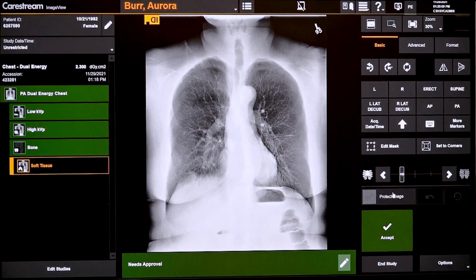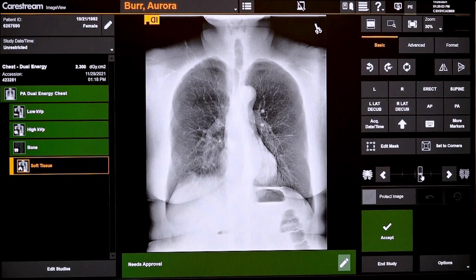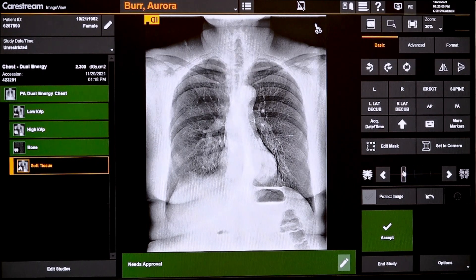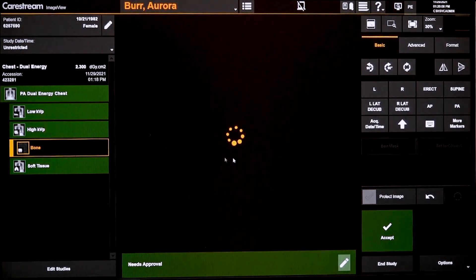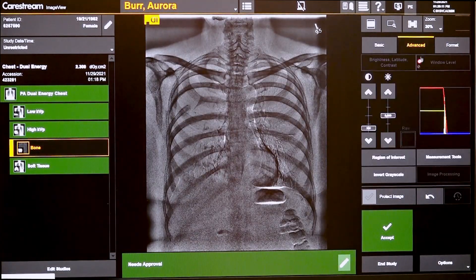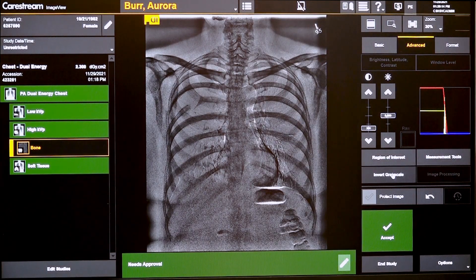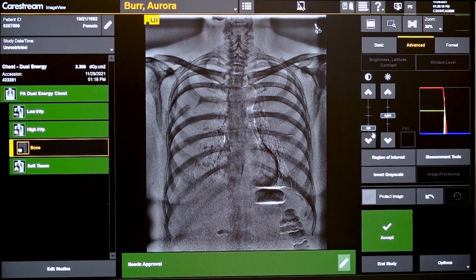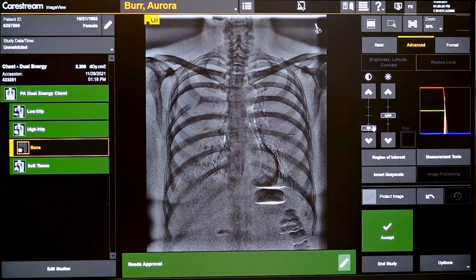As far as the ability to manipulate these images at the console: on the soft tissue image you can adjust the bone transparency using the slider on the basic tab. For the bone image, if you go to the advanced tab you have the ability to change between black bone and white bone. Any configuration settings are done at the view settings level prior to acquisition.